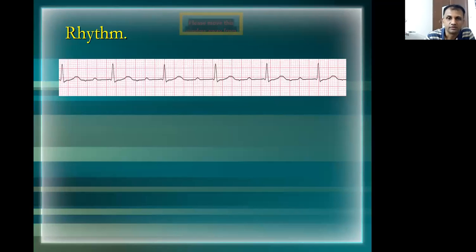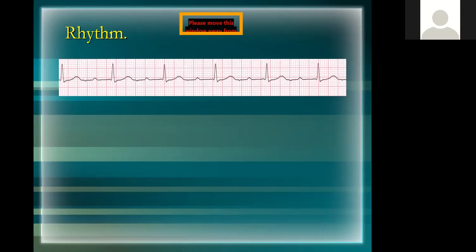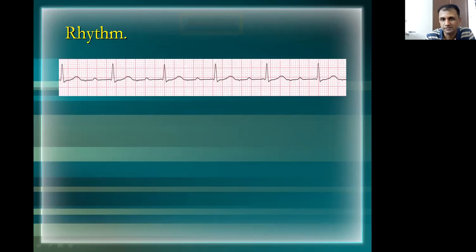Okay, this one. What rhythm is this? Normal or abnormal? If it's abnormal, what abnormality? Normal. Why do you say it's normal? I know it's difficult for you to just trace. Sir, prolonged PR interval is there, sir. Yeah, that's it. Now you got the diagnosis. What's your name?